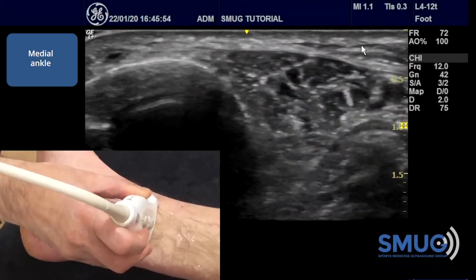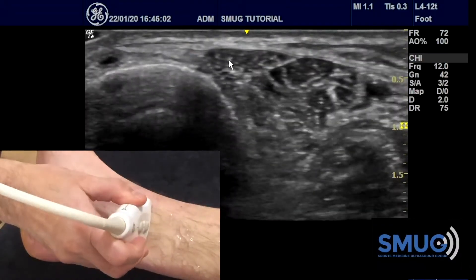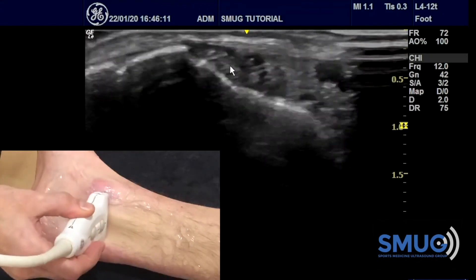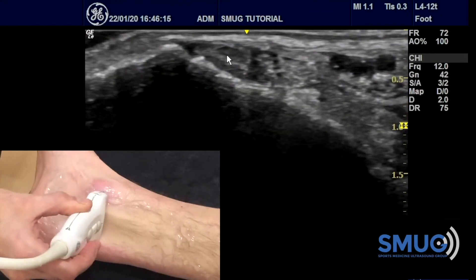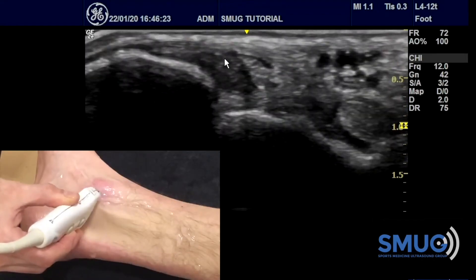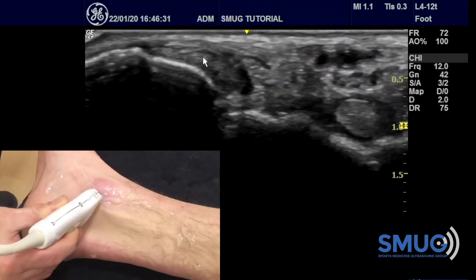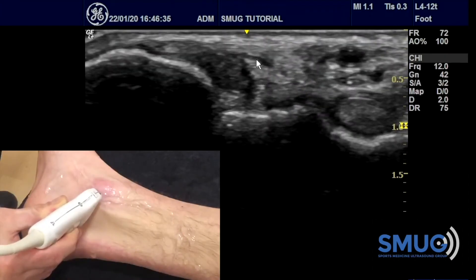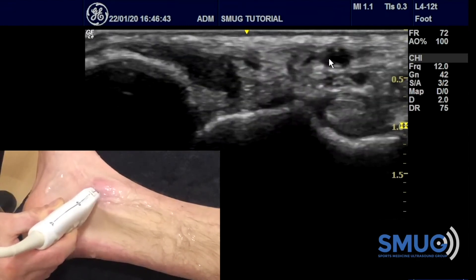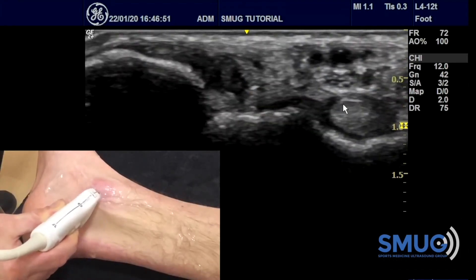For the medial ankle, start about five centimeters above the ankle where you identify a big tendon on the posterior side of the tibia — tibialis posterior. Follow it straight down until you see a concave groove where this tendon sits — use that as your landmark. Then angle the posterior side of your probe towards the heel. You should be able to identify all the structures: tibialis posterior first, then a very small rounded tendon which is flexor digitorum longus, then the arteries and veins — you can compress the veins — with the tibial nerve underneath, and then flexor hallucis longus.